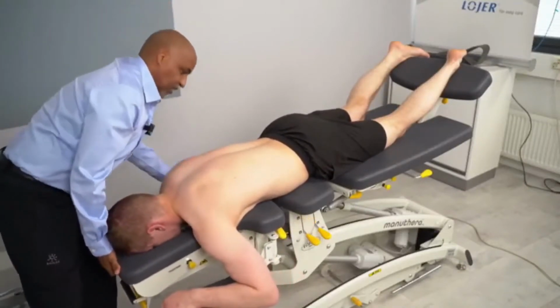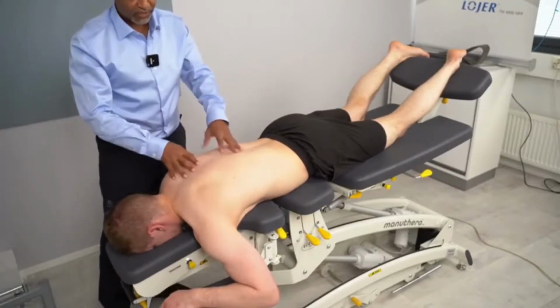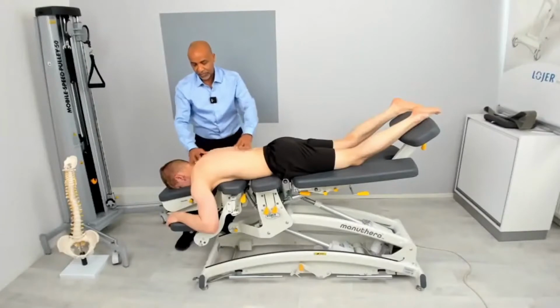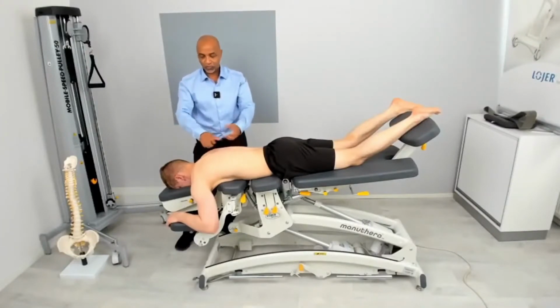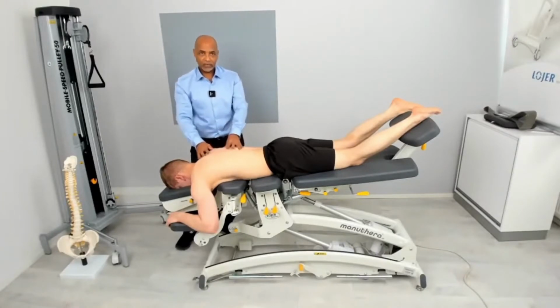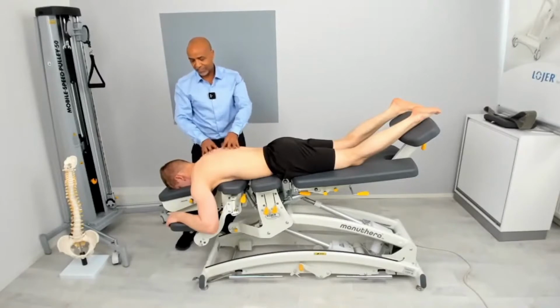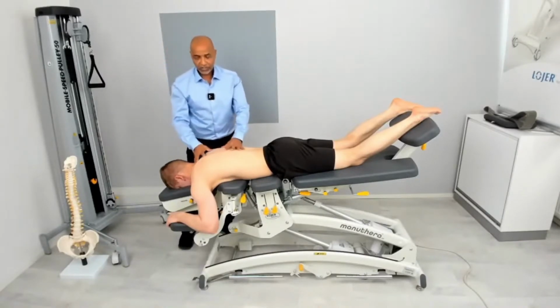Thankfully, this particular innovation of Manuthera 242 has created a way that this problem can be solved. For so many years there has been no proper way to do rotation or flexion extension of the spine manually. With the assistance of this treatment table, it helps us make sure that the whole system is covered.